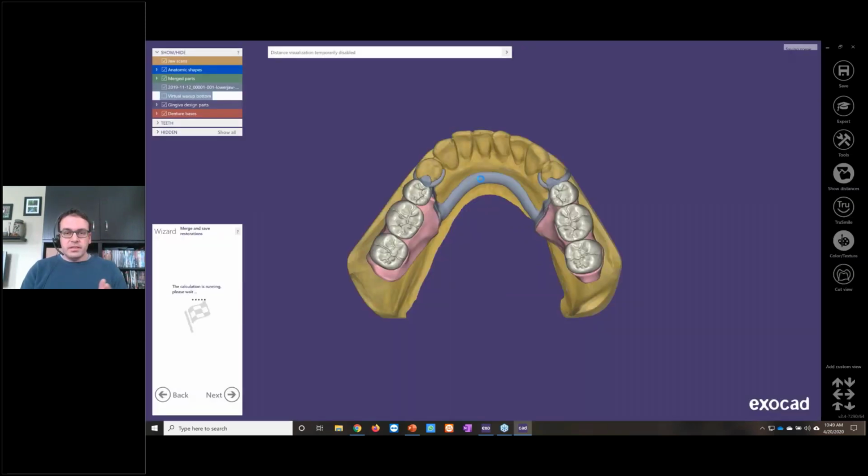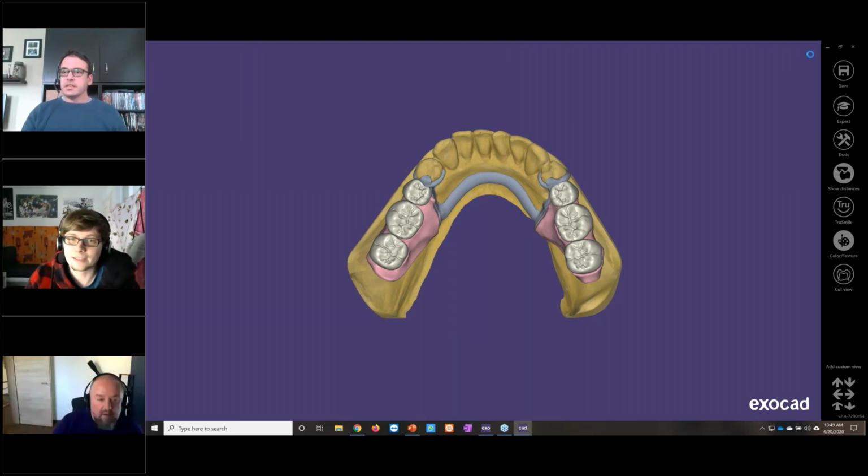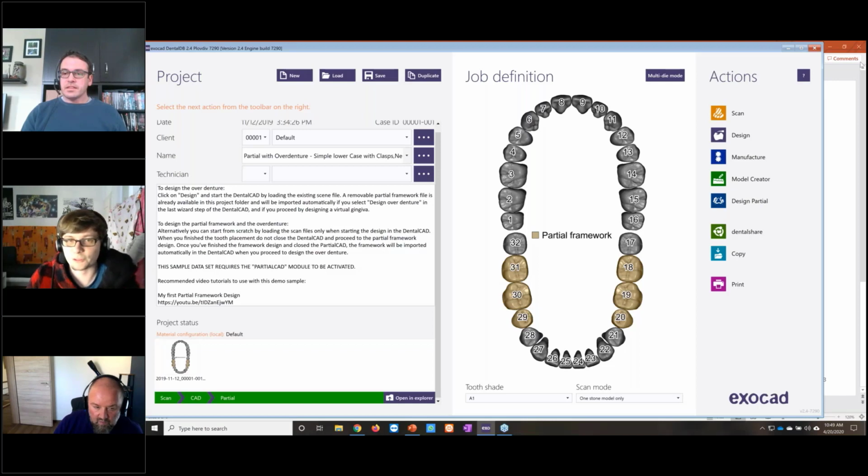Friedemann or Michael, any questions or anything you guys want to bring up or share? Yes, there was. Oh, you go first. No, go on. Okay, there was a question about the parameters for the partial framework in the end when you merge the whole pieces. What are the settings you can use there?